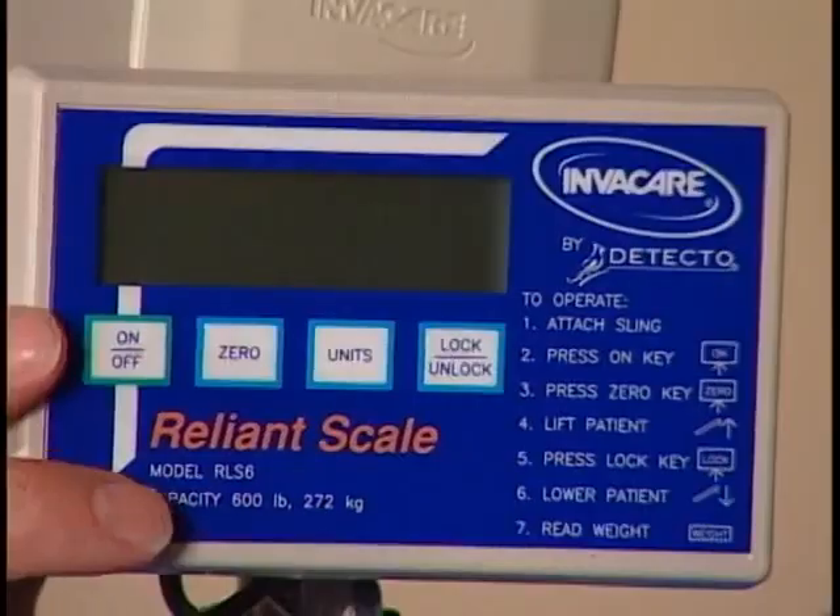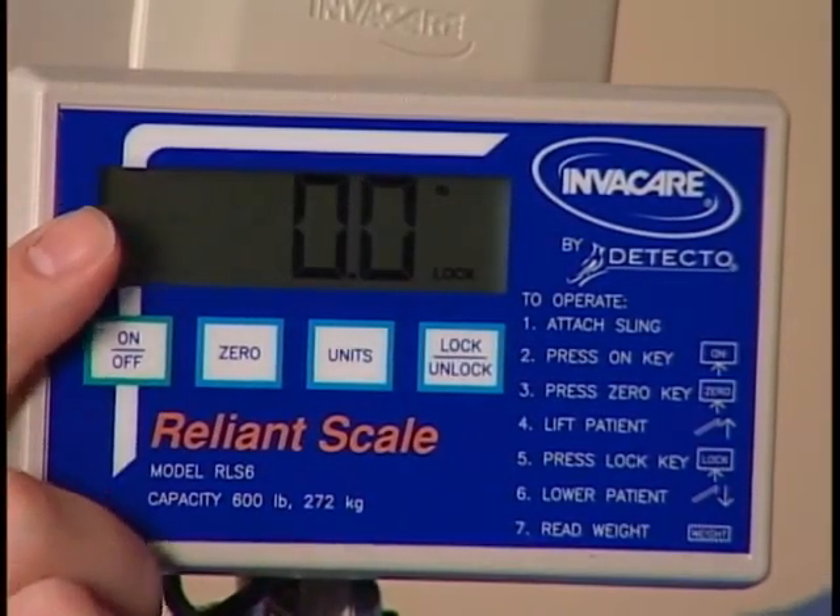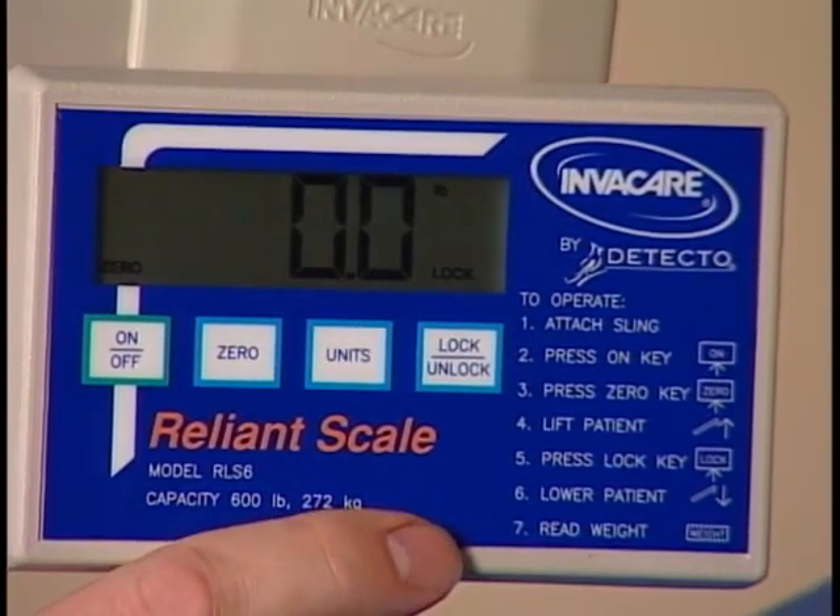The scale is easy to use with clearly labeled controls, an easily read display window, and operating instructions printed on the face panel.